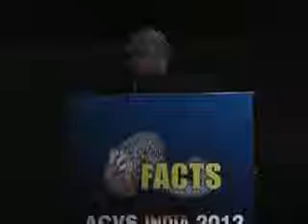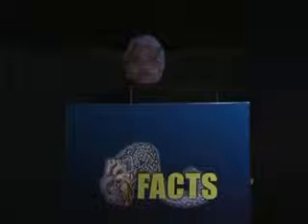And this is the way we close the arteriovenous loop. You have the delivery sheath in, and that is the ductus device closing it. In the next case, a 15-year-old girl, again a left sinus to RA fistula, same technique. Of all these, this case was particularly interesting and particularly challenging.